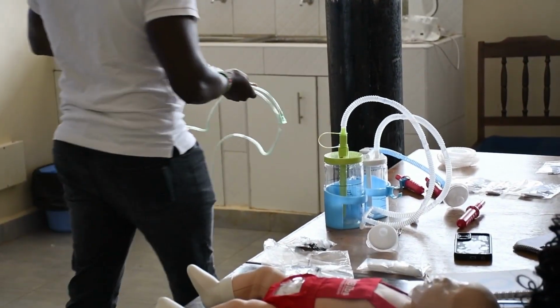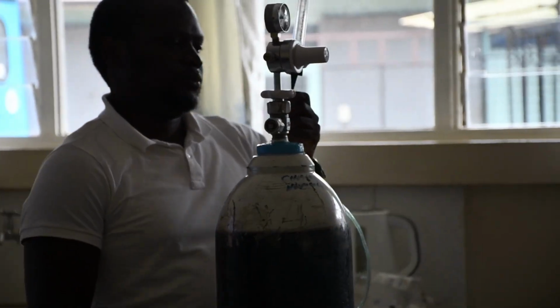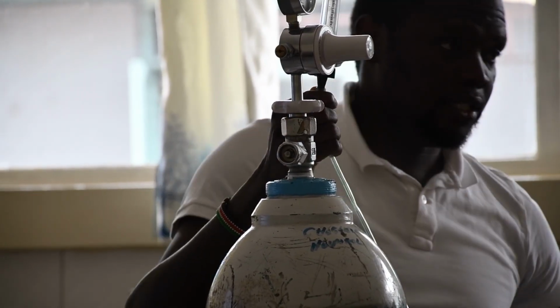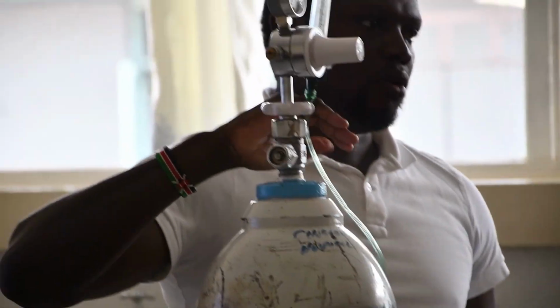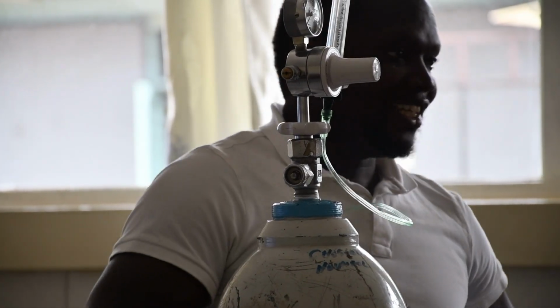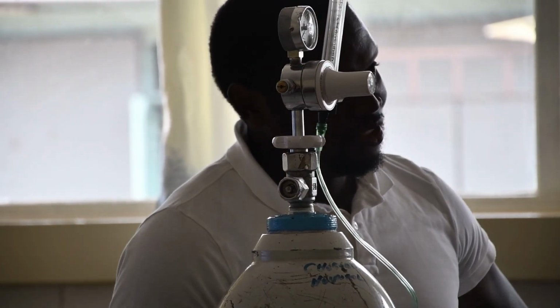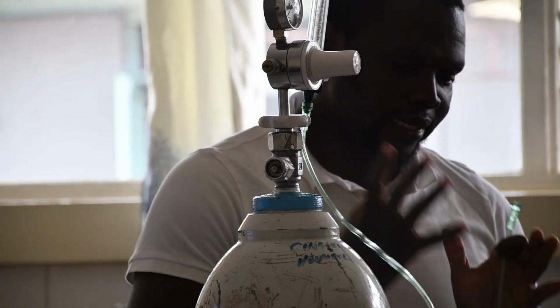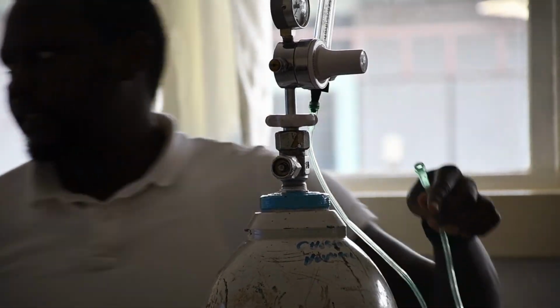From that point on, you're going to have your oxygen tube. When you do the fitting, always make sure that it fits on tightly. Just remember this always: any leakage leads to non-functionality of the device. So you always want everything to fit on tightly.